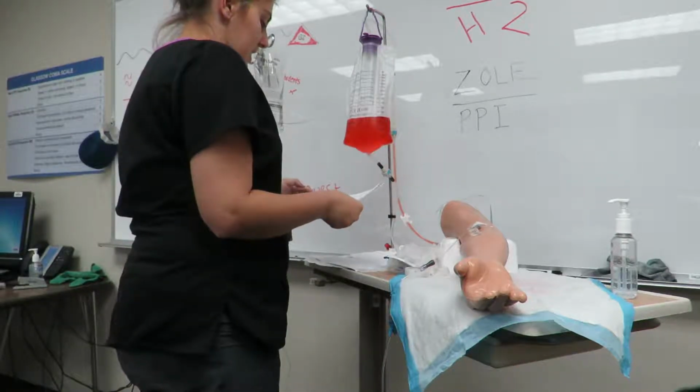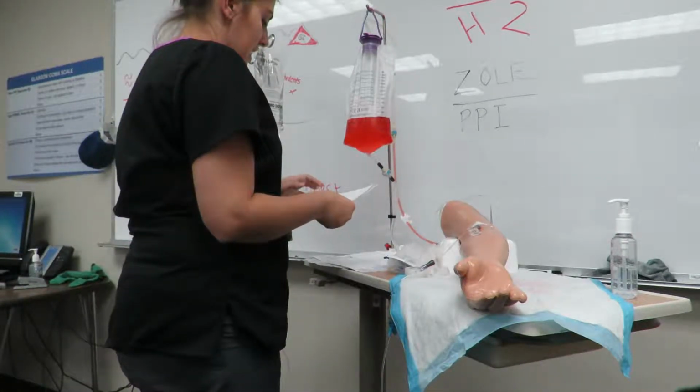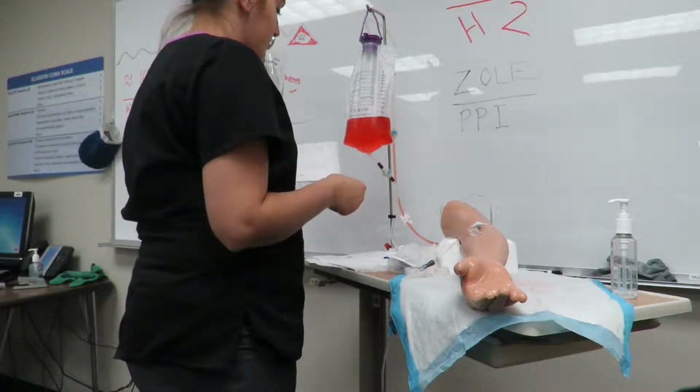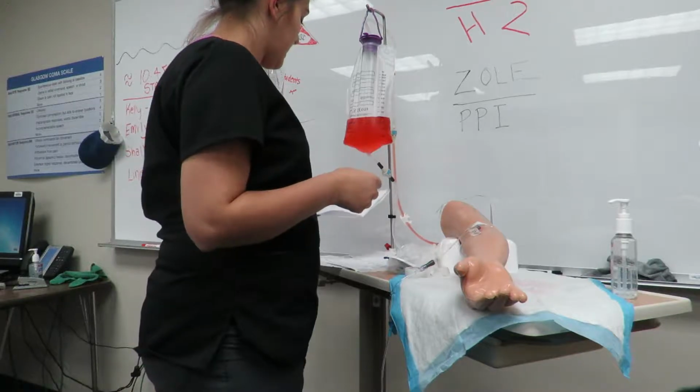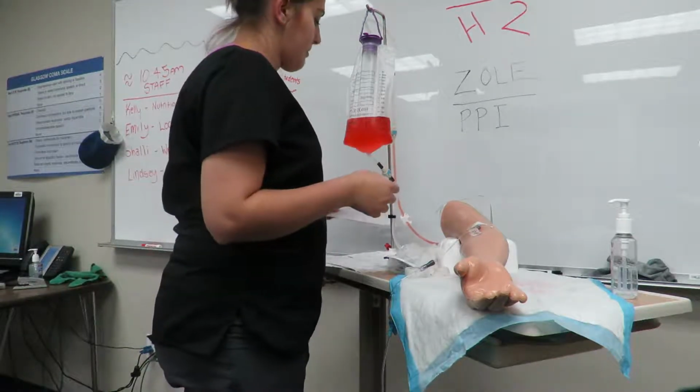The rate we're going to be giving it is 50 mLs per 40 minutes, which equals out to be about 12.5 drops per minute. I don't know if I said that right. So 12.5 drops per minute.